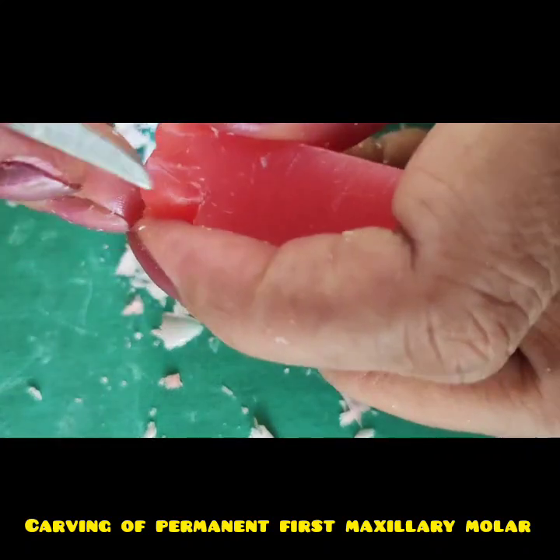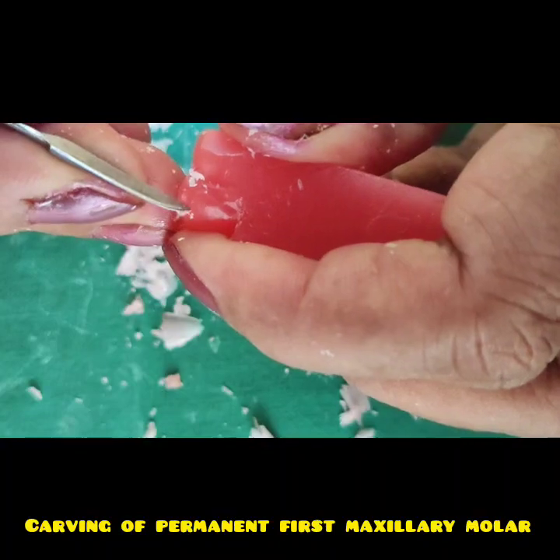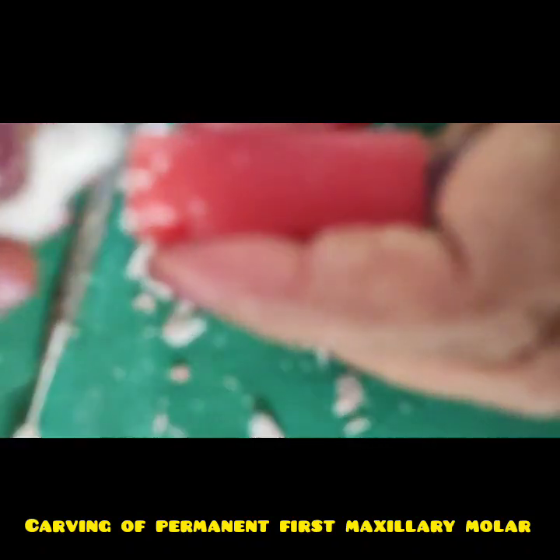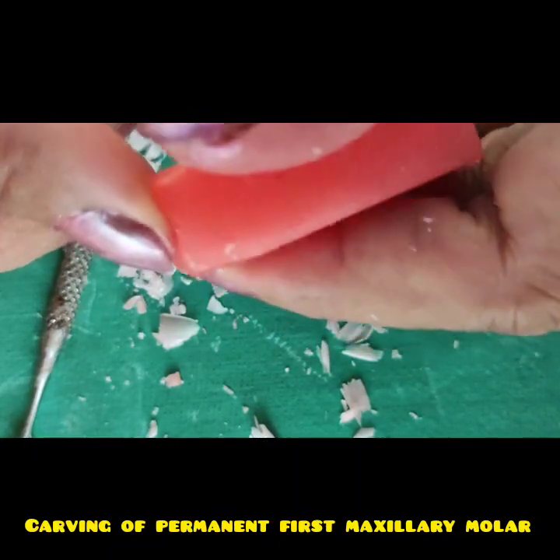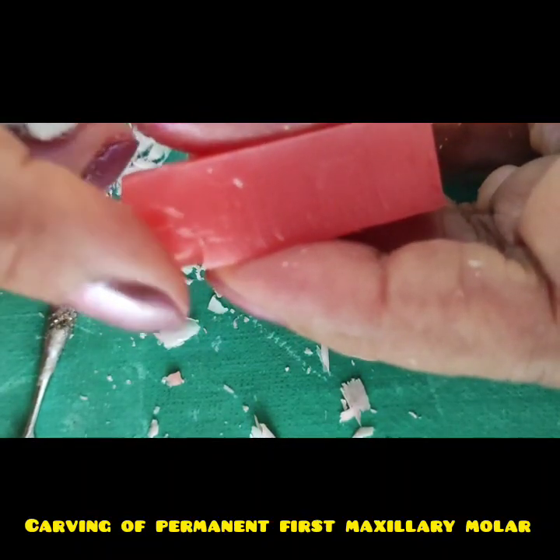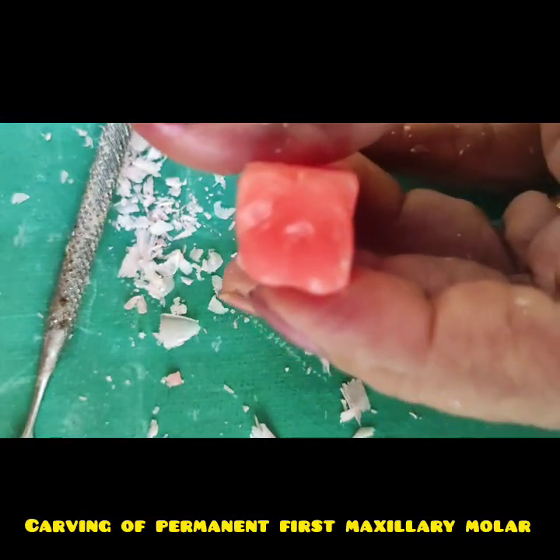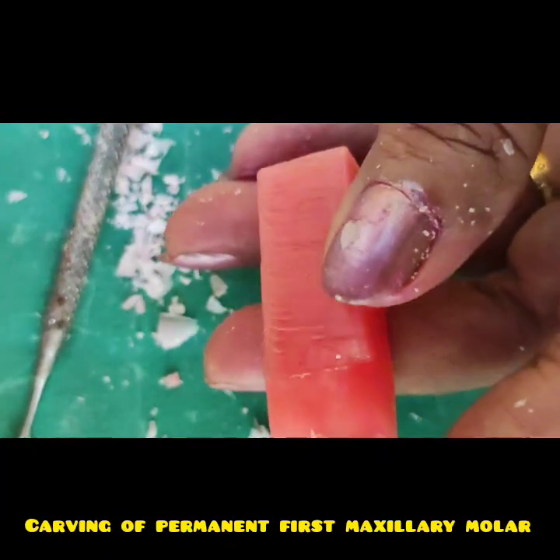And the cusp of Carabelli. What you can do is just remove 1 mm of wax from the cusp tip till 2 mm, and then you will see a step. So this is our cusp of Carabelli. So this is how we do permanent maxillary first molar carving.